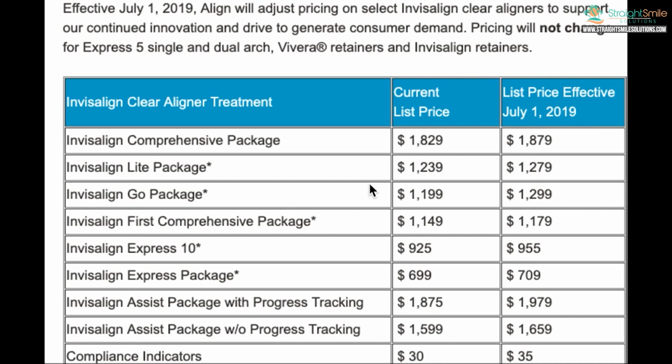It is about $600 cheaper. There's some limitations, so choose carefully if you think it's a light case. Got questions, feel free to ask me.